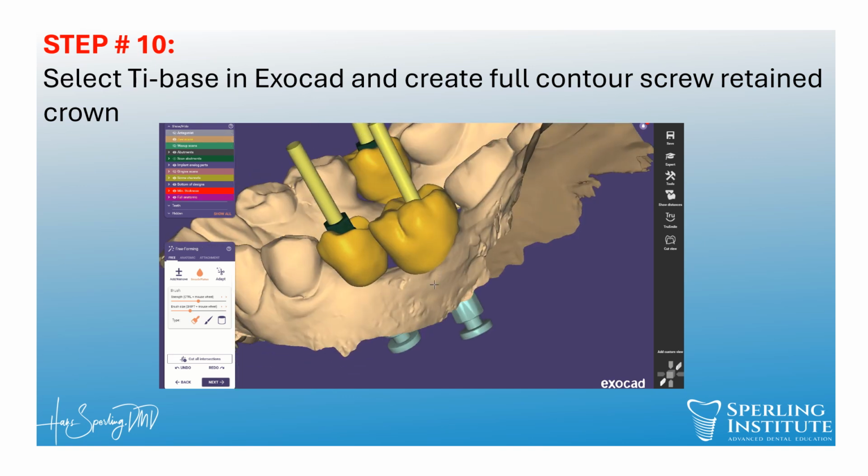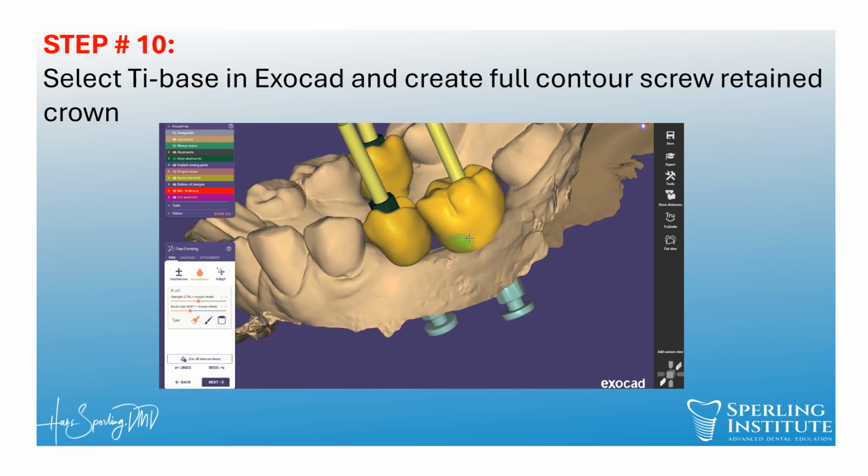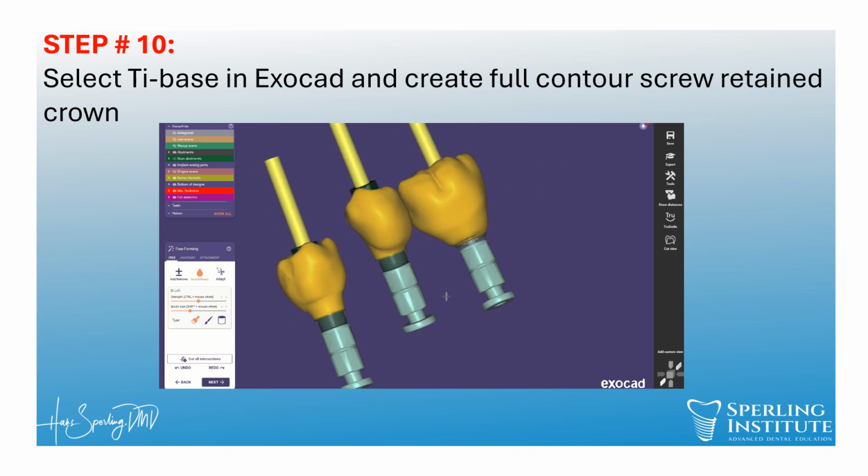I will be doing the same thing. Using my smooth tool here.